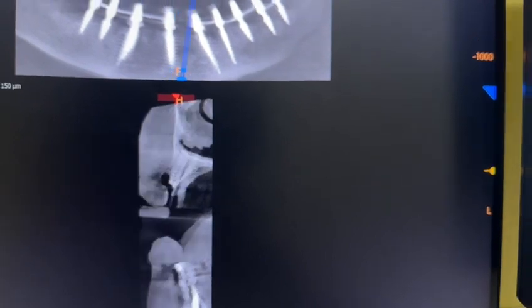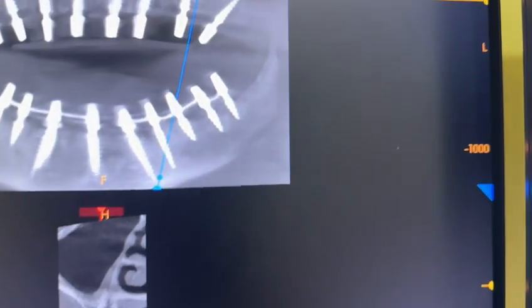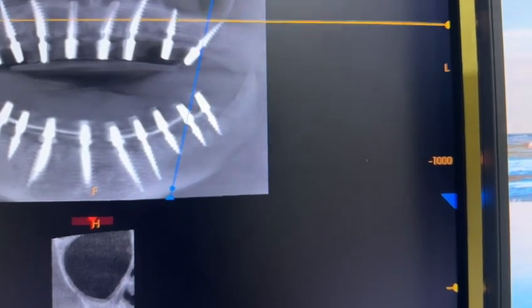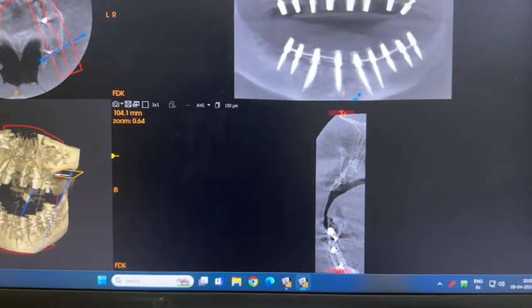3.5 into 14. This is the first premolar implant getting nasal cortical engagement. This is near the molars, palatal engagement into the palatal socket area. So the last implant is a kind of pterygoid, but it has not gone till the pterygoid. So we can appreciate that near pterygoid implant here.